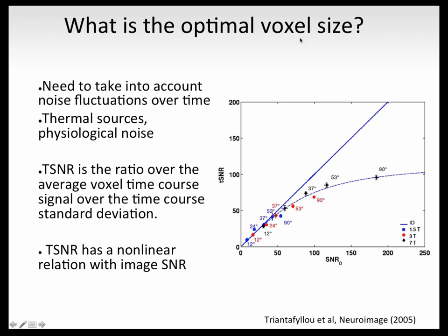If you wanted to consider what the optimal voxel size is, you're going to have to take into account those physiological fluctuations. If you had put a phantom in the scanner, for example, it's just going to sit there stably for as much time. So you get more signal, and you can average that over time. It's entirely fine. But you'll notice that if you actually put a person in, even if you get more signal, the artifacts that come from their breathing and their cardiac rate also increase. So more signal does not mean that we can actually extract more of the fMRI signal that we're looking for.